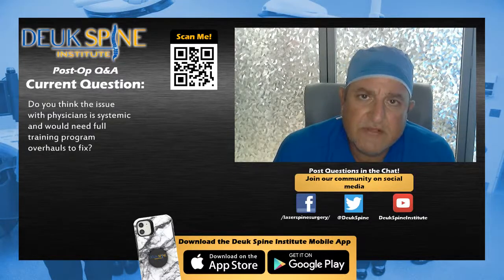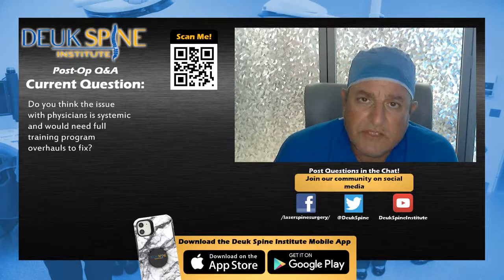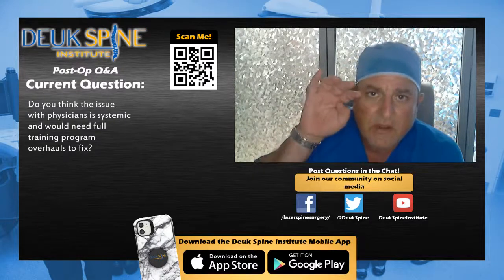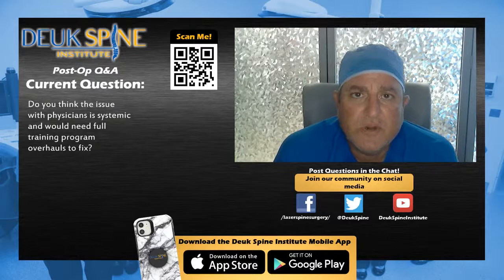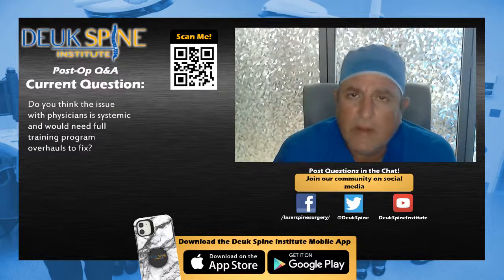I found tears in all three in the back. They're called annular tears, and that's where the herniations went out through the annular tear into the epidural space. And those herniations were pushing on the nerves, causing arm symptoms. Also, they were being kind of broken down like a glacier melting over time.